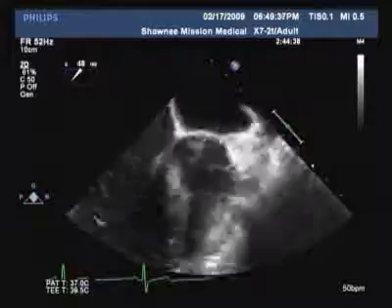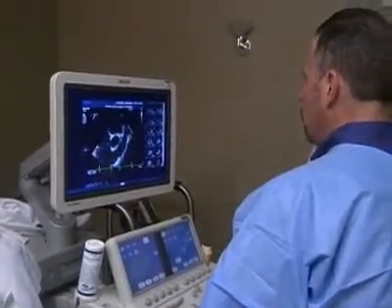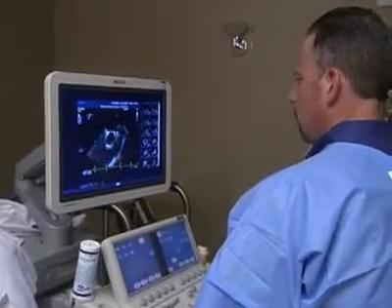That's exactly right. I think that's a great point, too. The bubbles can kind of direct you on how flow is going a little bit through the heart. One other structure I wanted to look at down here before we move to a little different area.